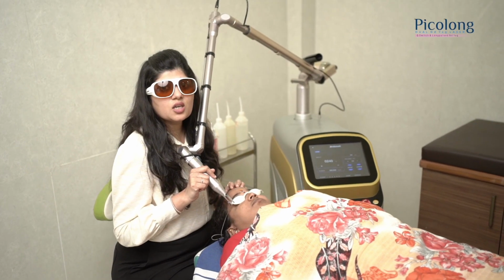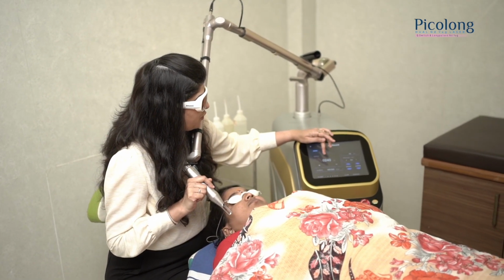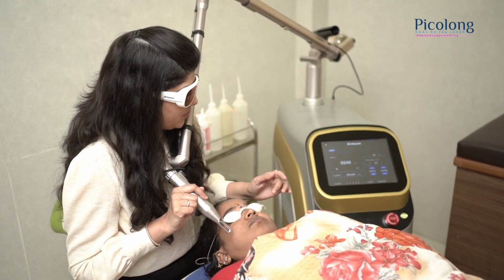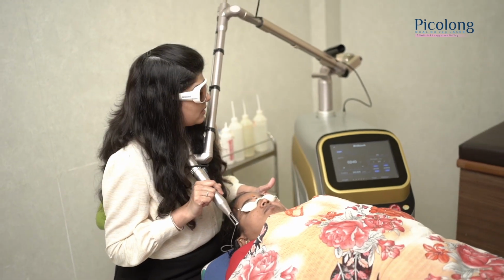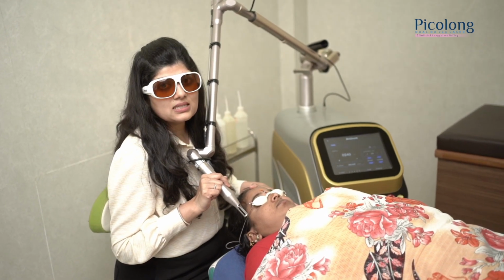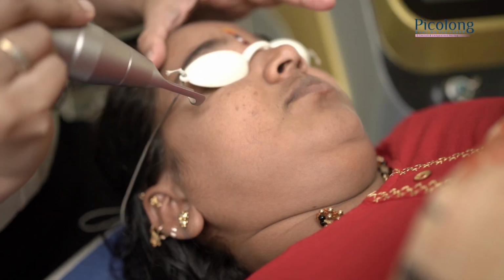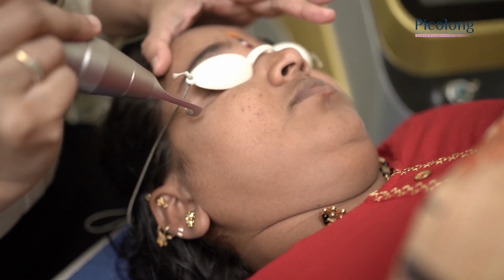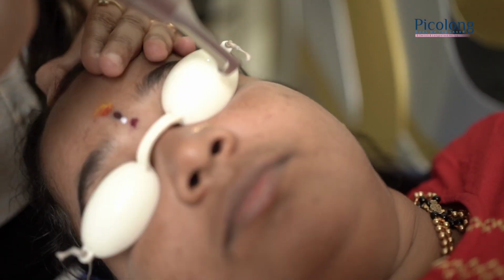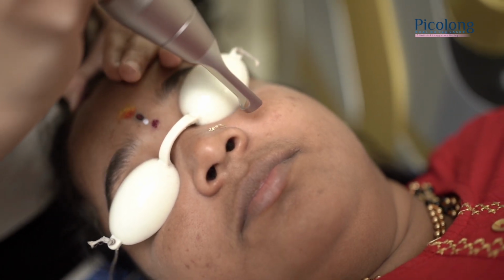Here I'm using Q-switch mode for melasma. So I have kept an energy of 240 millijoules with a 6 mm spot size, and the frequency is 4. Always ask if the patient is comfortable, and the patient should only feel the heat of the procedure. But if the patient is uncomfortable, please reduce the energy. As you can see, there is a subtle change in the skin tone, very mild erythema, that is the end point. Cover the whole area. The energy that you use on both sides might not be the same. It also depends on the depth of the pigment. So if you feel it is not working, you can even go ahead.